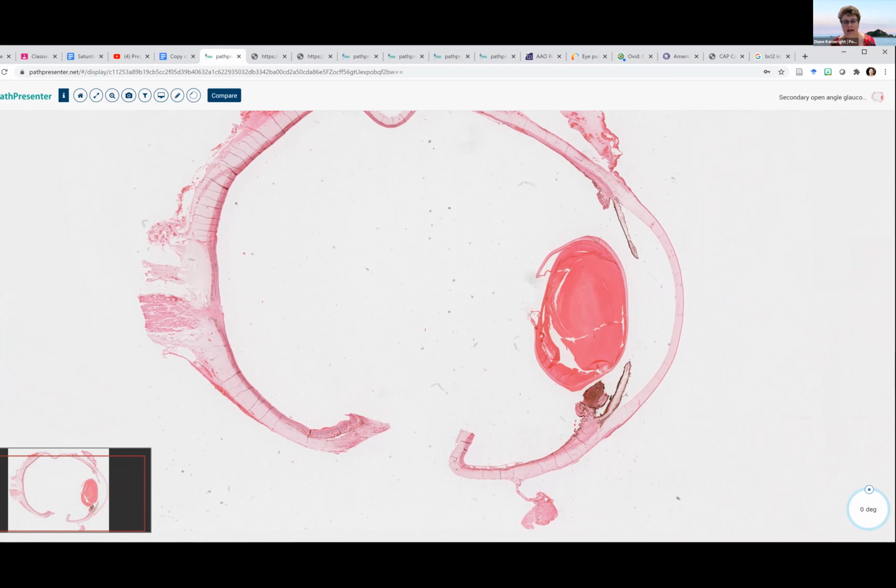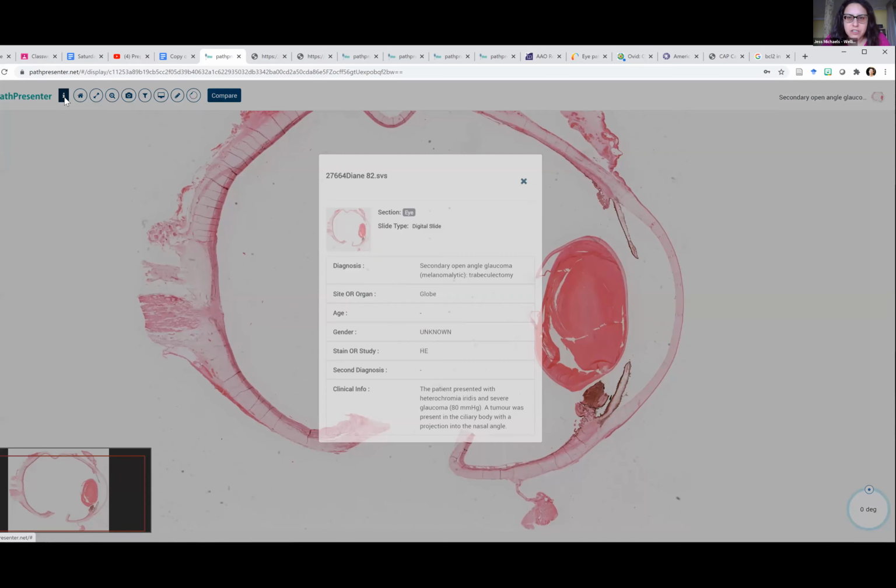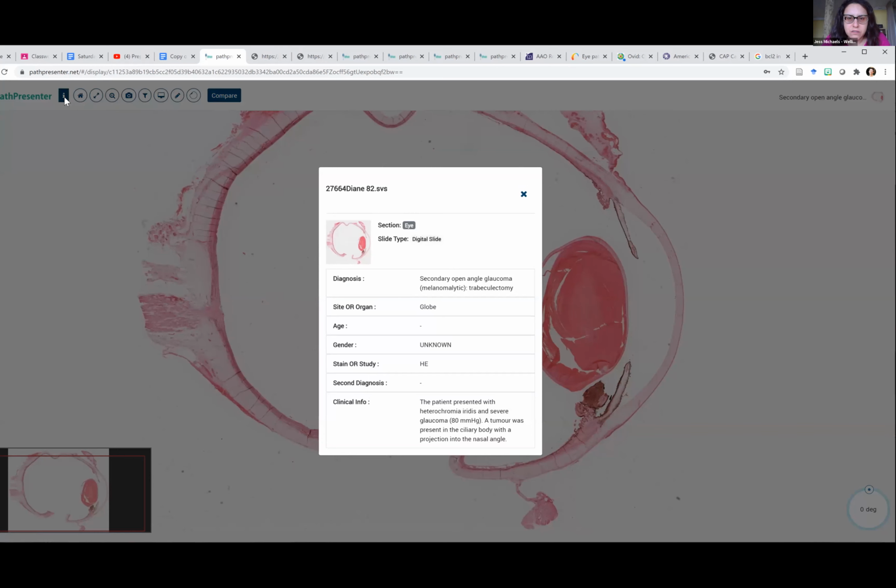I missed the trabeculectomy. What's a trabeculectomy? Oh, trabeculectomy, yes, sorry. Yeah, that could cause post-treatment glaucoma too. I think it just might say in the information trabeculectomy, but I didn't know if it was in this slice. What does the info say?